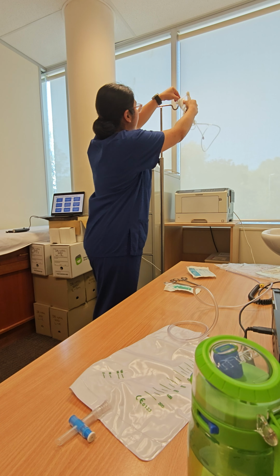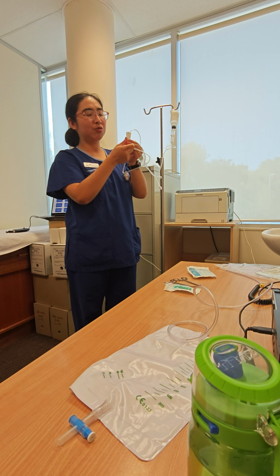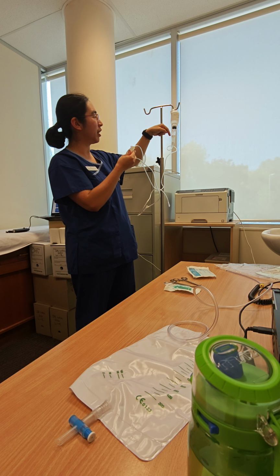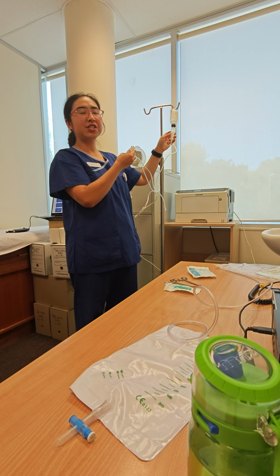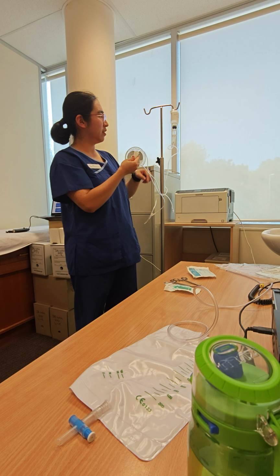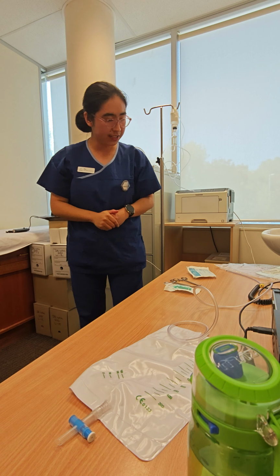So we hang it up in a higher place like that, just to make sure the bottle is rolled to the bottom. We're going to have a test, just move it up a little bit to see if the fluid comes out. If not, that means something is wrong with the needle. We can change the needle to a thicker one or adjust the angle until we can see the fluid dropping out. If it's working very well, we can just close that and hang it there. Everything is all set up.